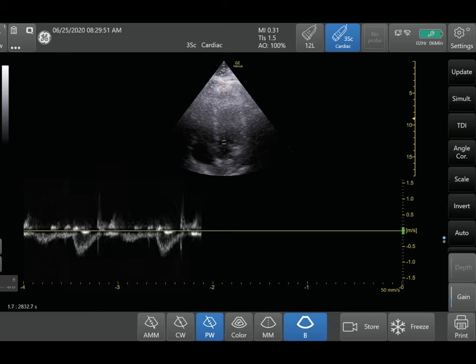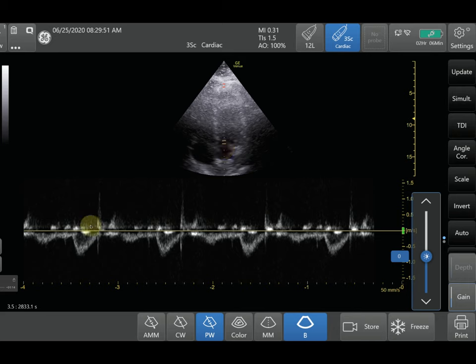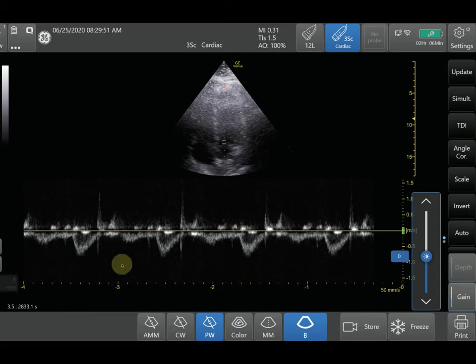When you activate it, you'll notice the tracing goes downward. This is because the flow of blood is going from the left ventricle down toward the aorta, which is why you're detecting a downward flow. Now we're going to go over how to optimize the Pulse Wave Doppler settings to give you the best measurements.